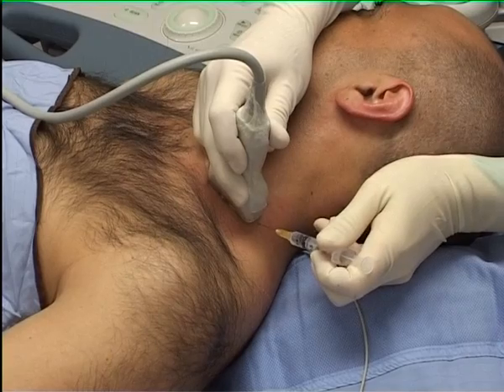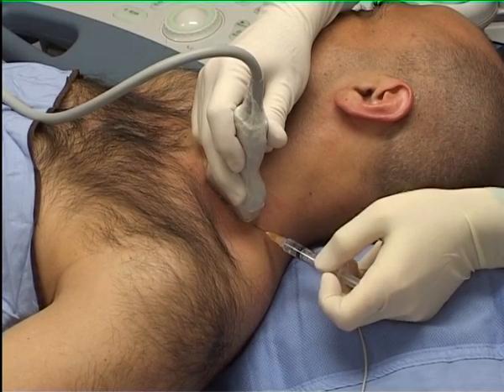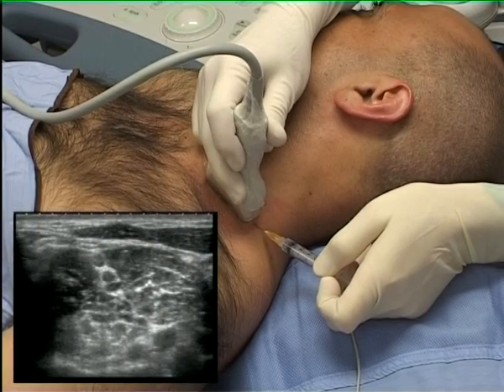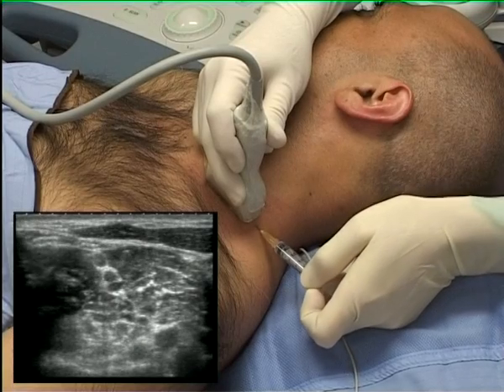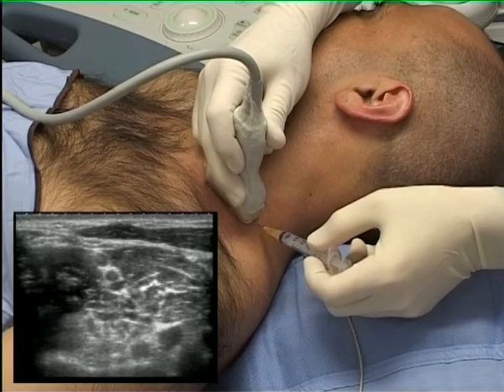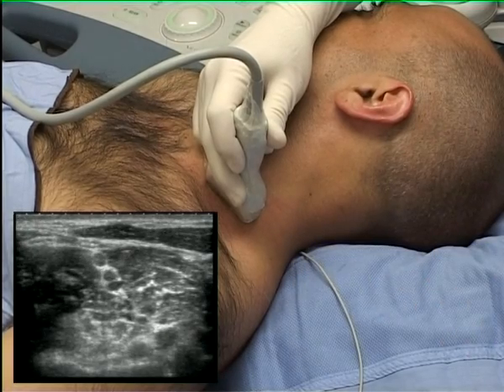Note that the scanning hand rests on the patient's neck to maintain a stable image. Puncture site analgesia can then be appropriately placed in the midline of the probe. The injection can be observed on the left side of the image within the medial scalene muscle.